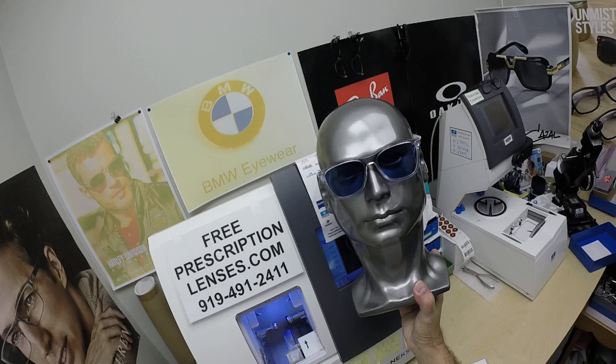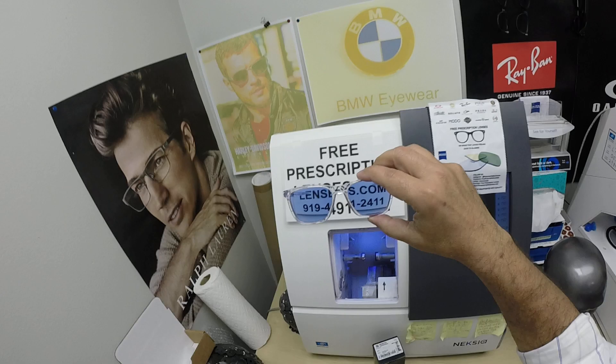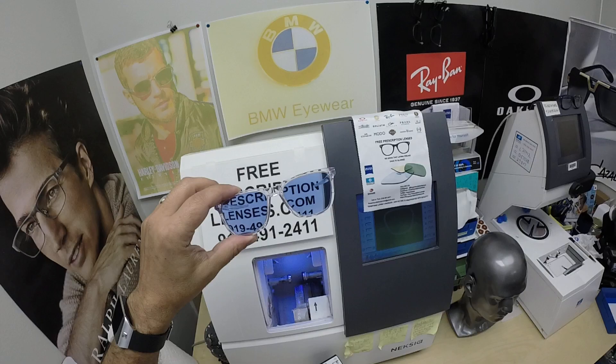The other nice thing about these Zeiss Photo Fusion lenses — they were the original blue blocking lenses. They block 30 to 50 percent of the harmful blue light emitted from today's electronic devices such as cell phones, tablets, and computer screens. Look how cool this looks — the blue tint with a crystal clear frame.